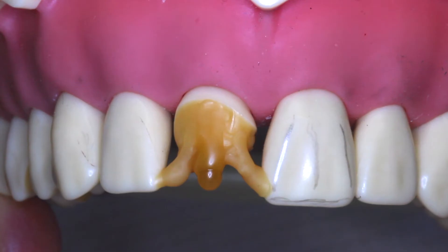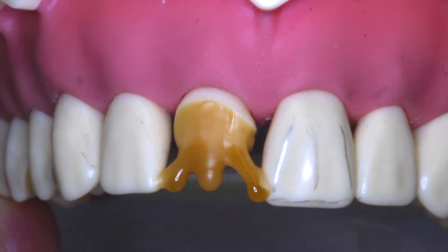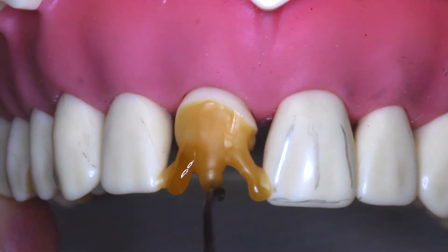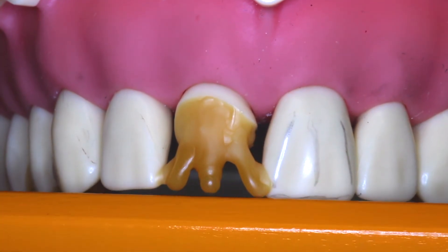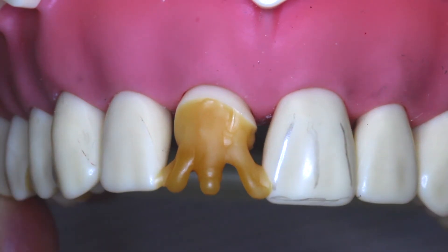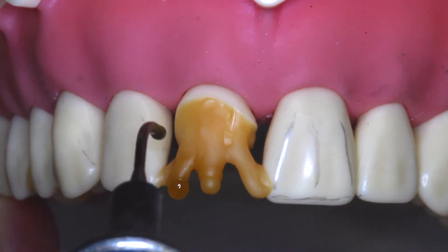They are the mesial and distal lobe and the central lobe, with a depression in between each one. I'm also developing the height of contour for the full length of the tooth. The pencil is a good way to show you if you've reached the incisal length of your desired wax up. You want to hold the pencil on the same edge as the adjoining central so that you can see if you've reached the desired length.